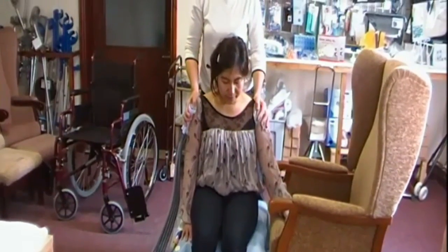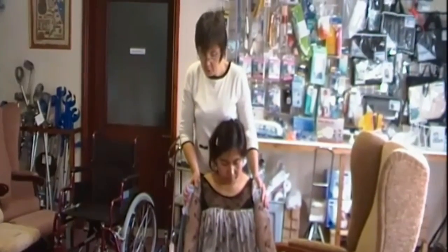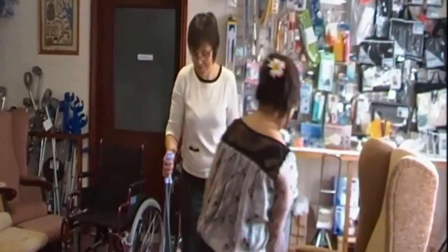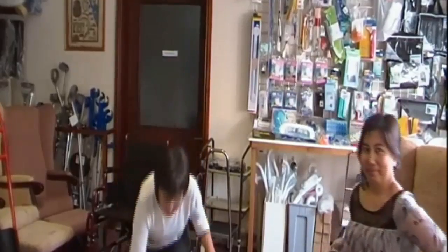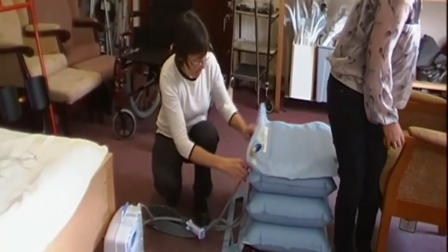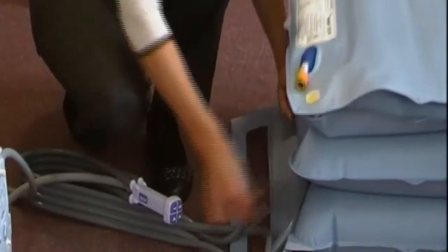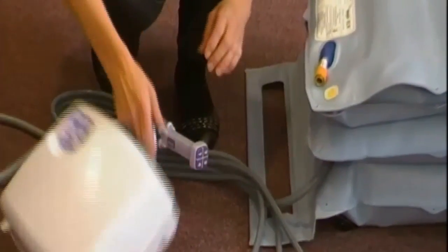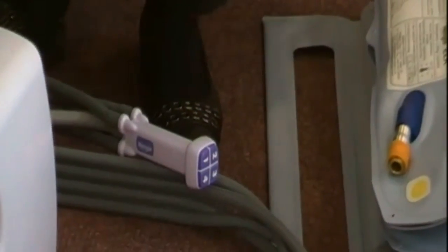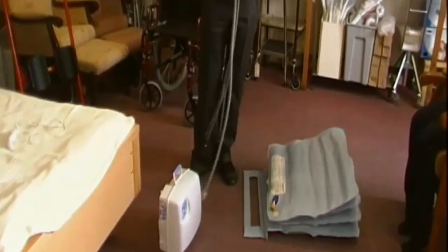As a general guide, if you're over about 5'8", you'd want to go up 1 more cushion. I think Grace will be fine to get up from here. Do you want to try, Grace? Brilliant. Okay. Thank you. Now to take the cushion down, you have to slide these bits and then they pop out. This comes off, you peg this and it comes off, switch that off, and you take your battery back to the charging station. With the Mangar products, you've got the option of having it electric or battery.